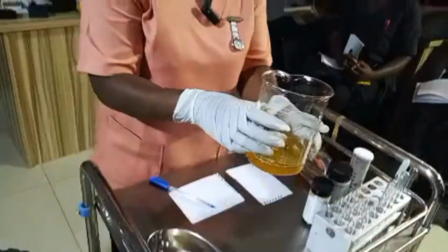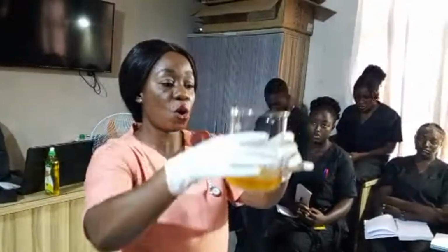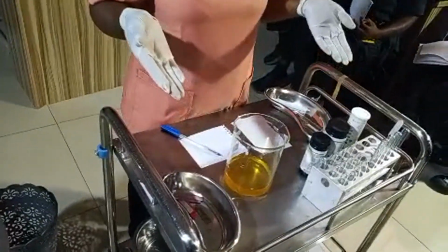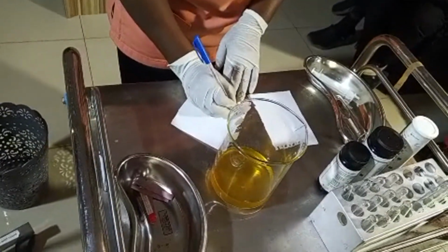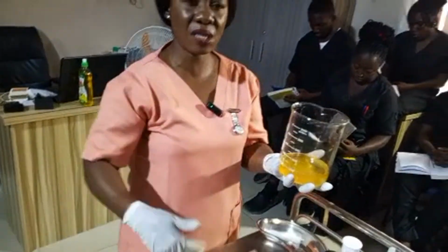So since we have our urine in a beaker, you can see the deposit, right? You can even lift it at eye level, or you can even look at it directly. Since my container is wide, I can easily see if there is deposit, and I will write deposit present. You can do this within like 30 seconds.